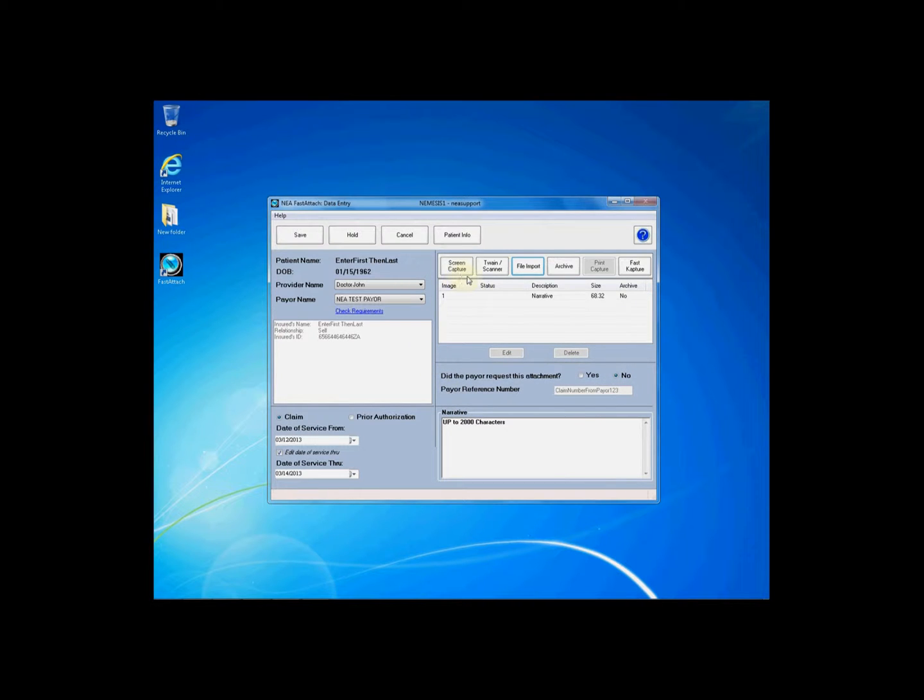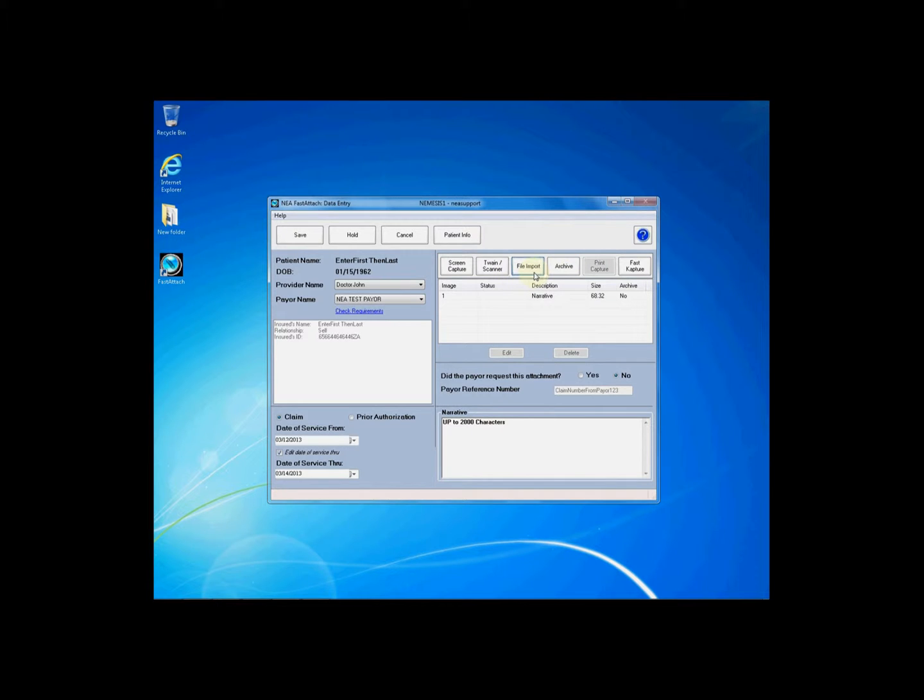there are many acquisition methods available within Fast Attach to acquire your documentation and images. This video focuses on File Import. Let's start by clicking File Import.